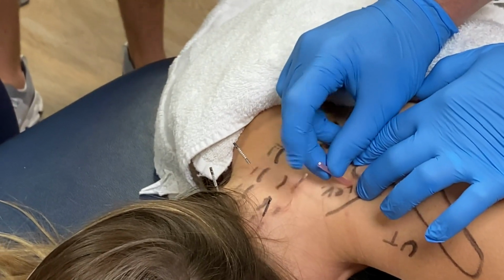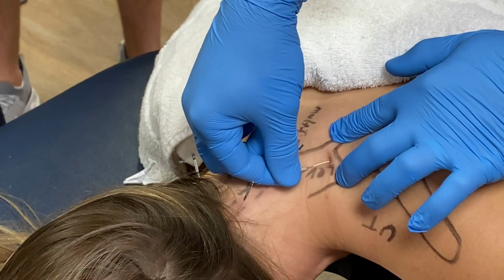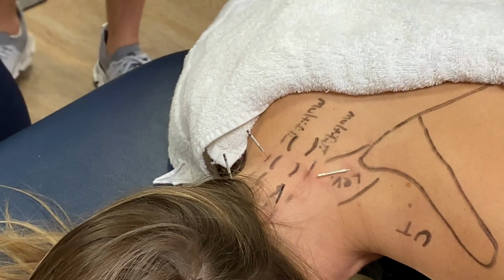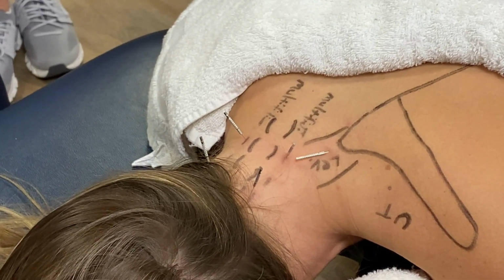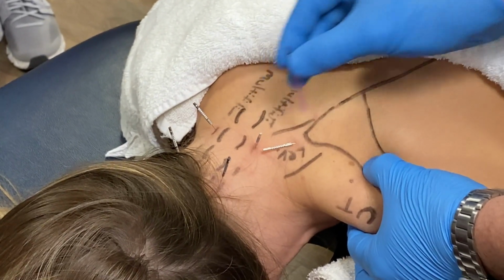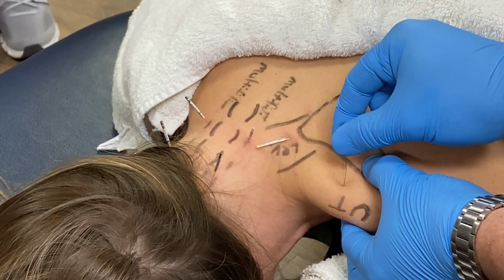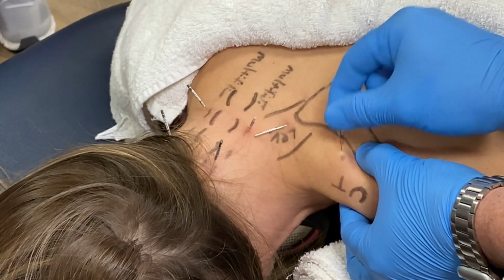So a little tap. Having a needle around other needles, that's part of the fun. You okay there? Mm-hmm. And let's do upper trap. So don't grab super aggressively because you already got a needle here. So a little tap here. Just needle this tissue in between my fingers. Ooh, nice twitch. Hey. Mm-hmm. See all those twitches?